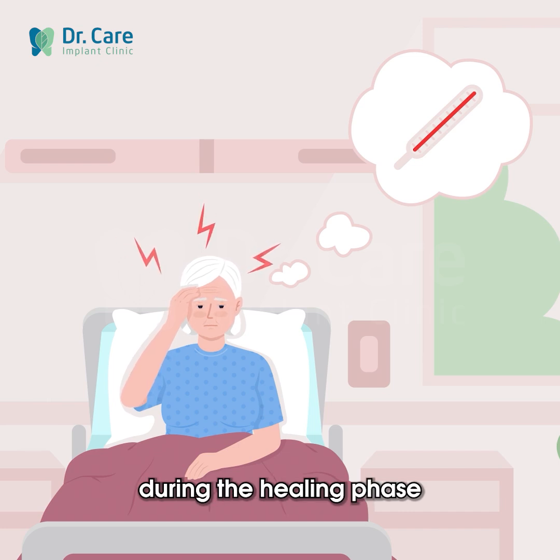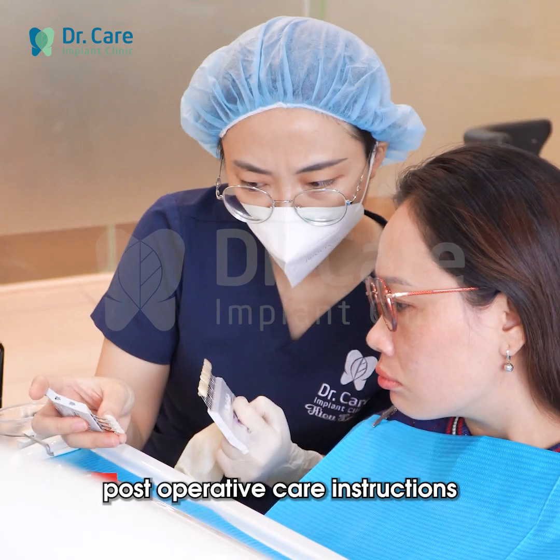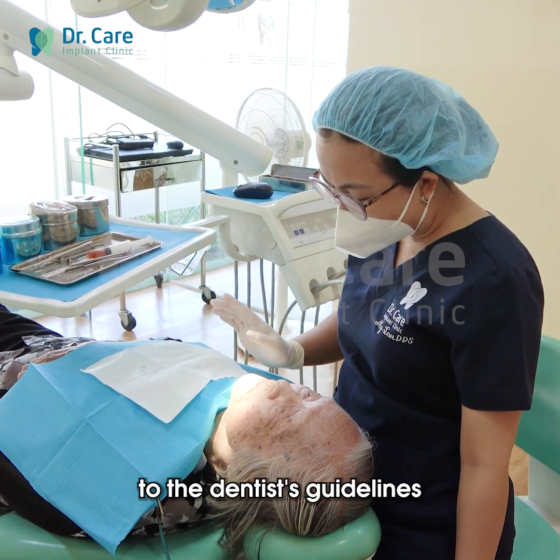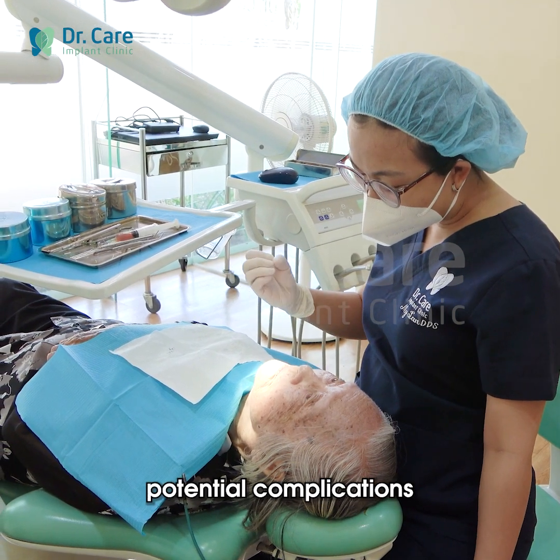during the healing phase. The dental team will provide detailed post-operative care instructions and schedule follow-up appointments to monitor graft healing. Strict adherence to the dentist's guidelines is essential to ensure optimal recovery and minimize potential complications.